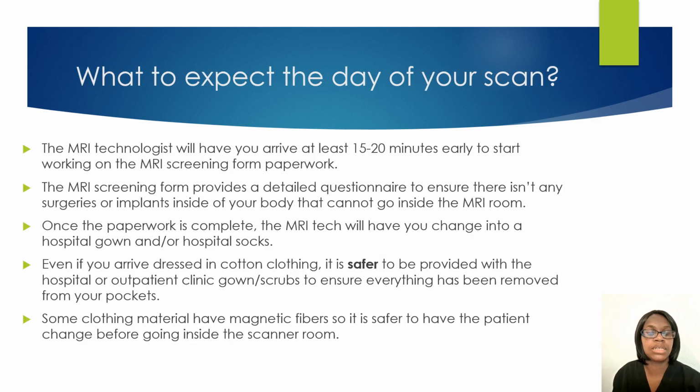For this information, a scheduling department or maybe the ordering physician may tell the patient about their MRI scan so that they can be better prepared. They want to make sure they arrive at least 15 to 20 minutes early to start working on their paperwork. If they do come at their scan time, it's going to make other patients late, so they should be aware to come early so that they can start filling out their paperwork.